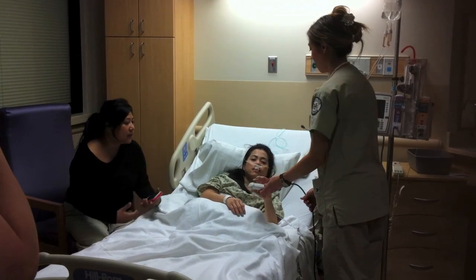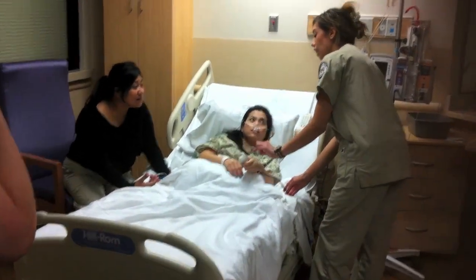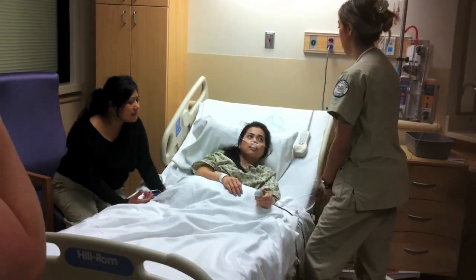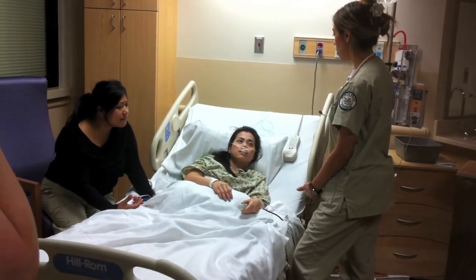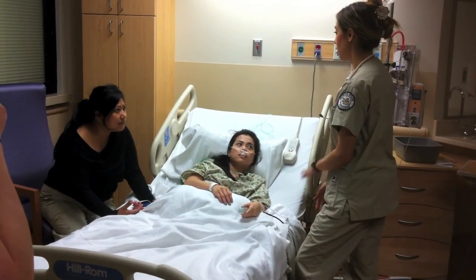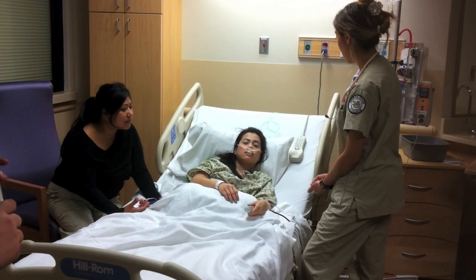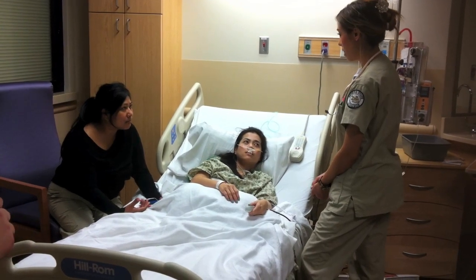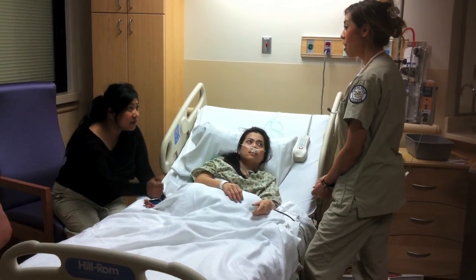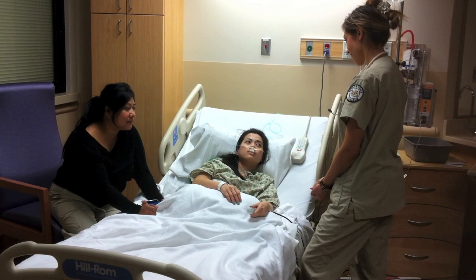When can I push it? When the light lights up, you can push it — that means you can have an additional dose. But we don't want you to overdose, so it'll lock you out after a certain amount of time. Only the patient can press the button.